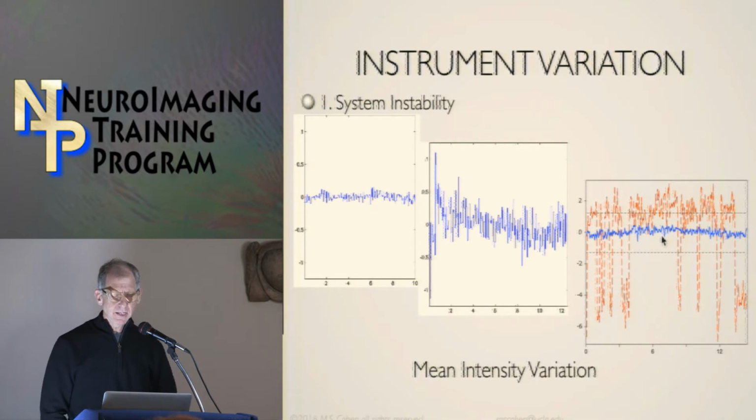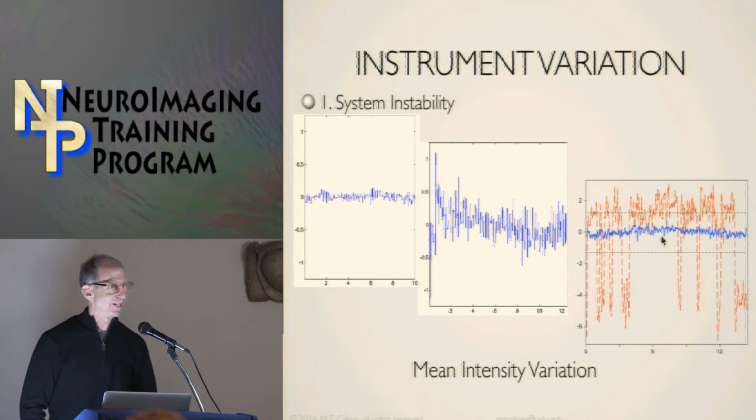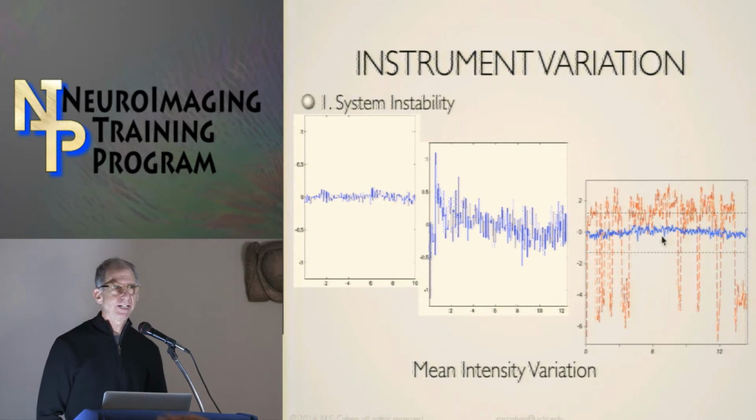is an omnibus test for whether there is something wrong. It's a relatively unspecific test for what is wrong, but essentially those things which would produce damage to our image are what we test for in here. But interpreting the data actually is a relatively subtle art. Scanners differ a great deal from site to site. One of the major problems has to do with the quality of the room that the scanners are in. It's very possible to have radio frequency leakage in the room, which contaminates the scans. And it's extremely easy for an unqualified person to create those leaks.